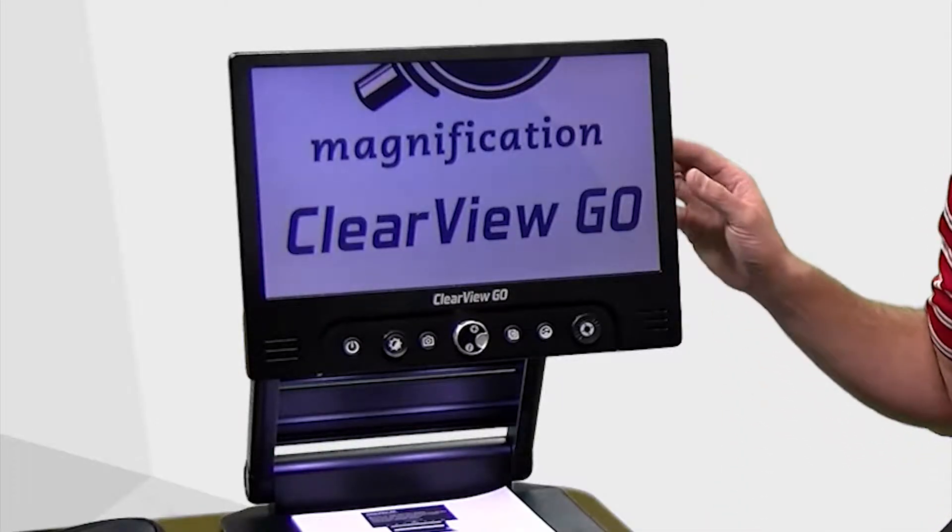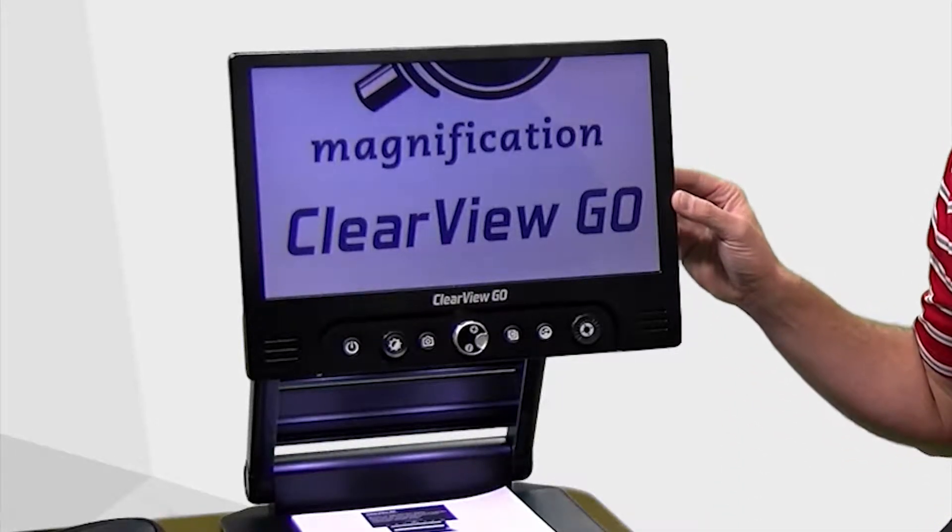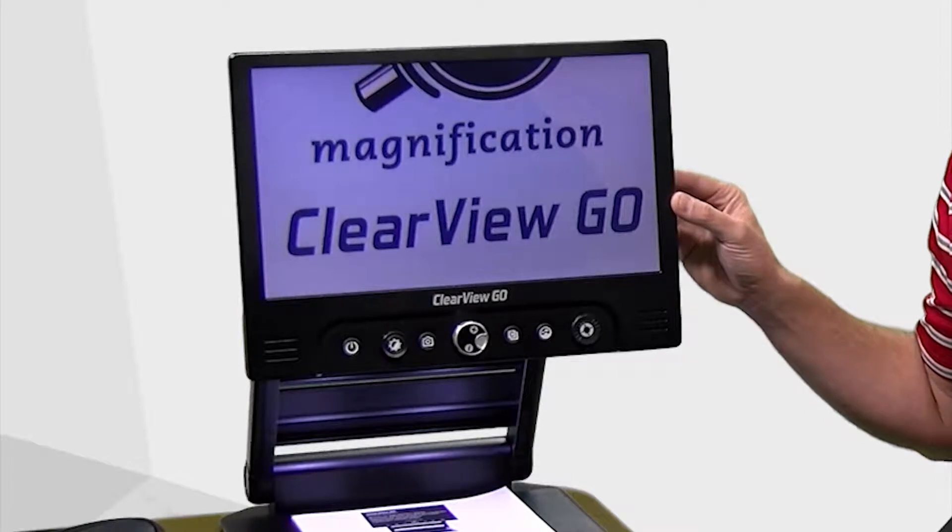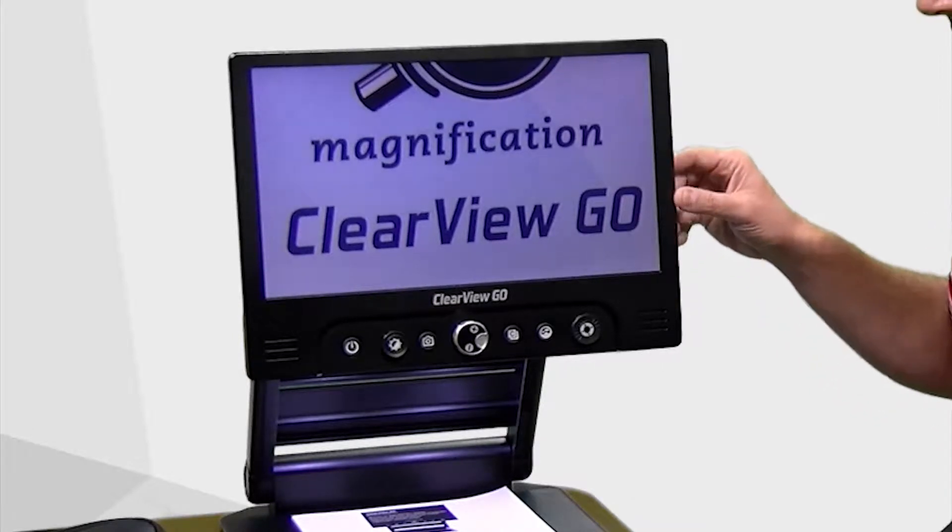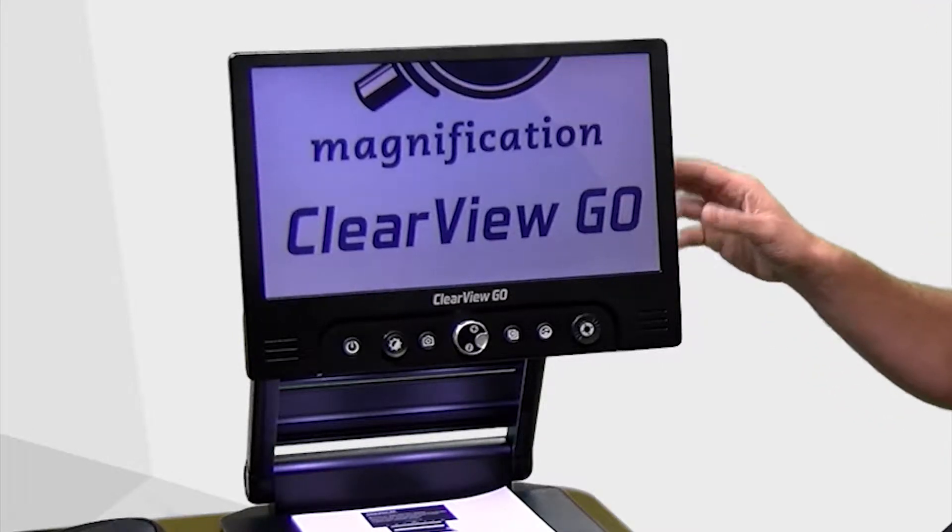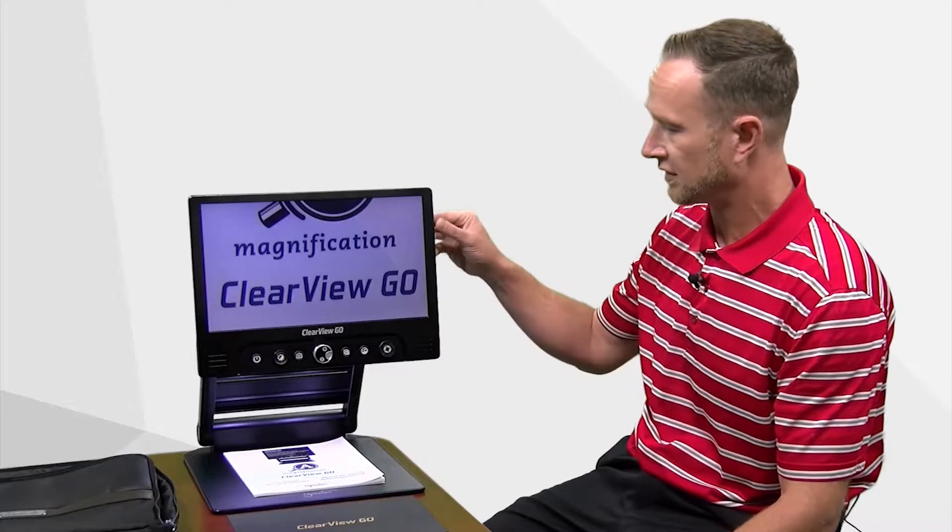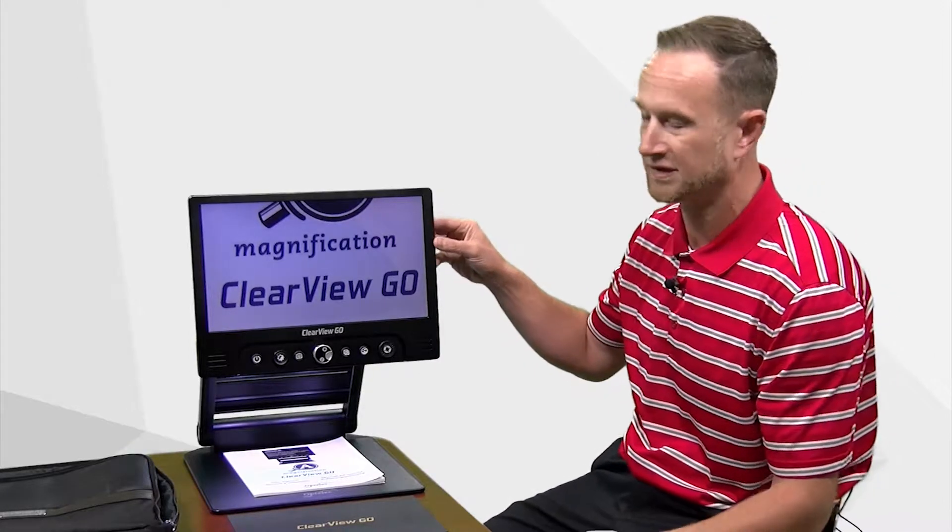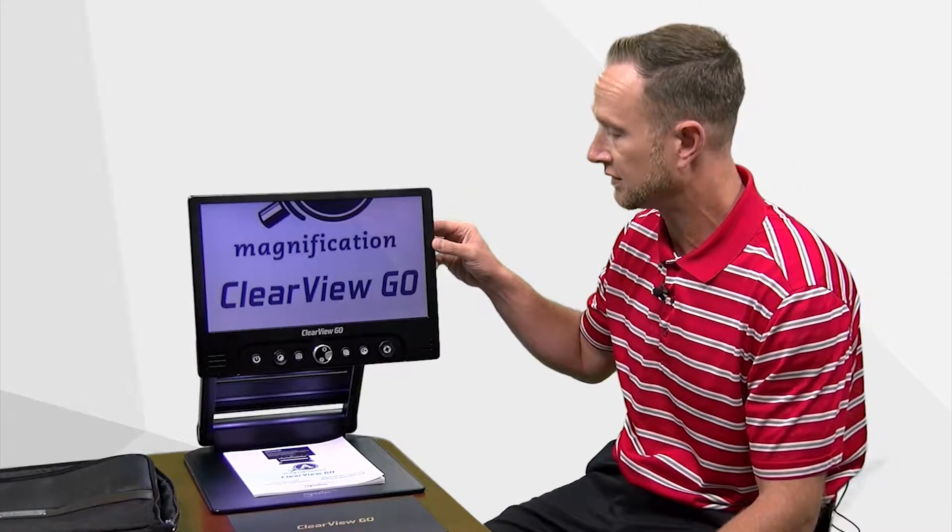The Optelec Clear View Go is a 15 inch high definition portable video magnifier that is meant to be taken wherever you want. Right now it is already unfolded but this can be folded up just like a laptop computer and taken with you wherever you go.